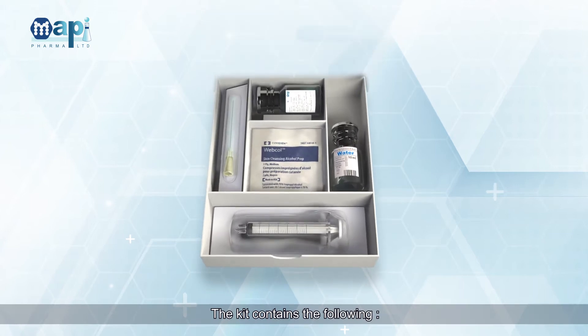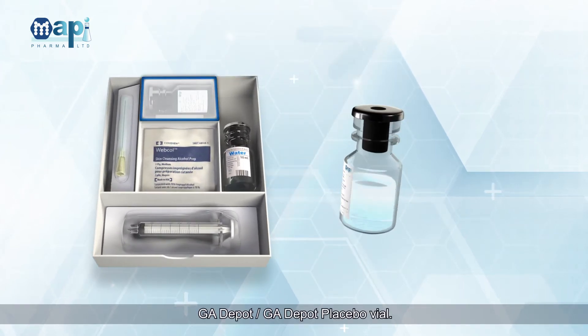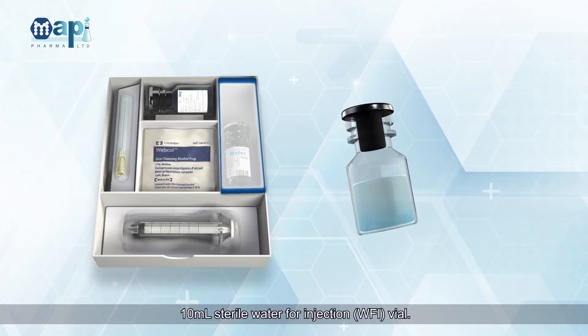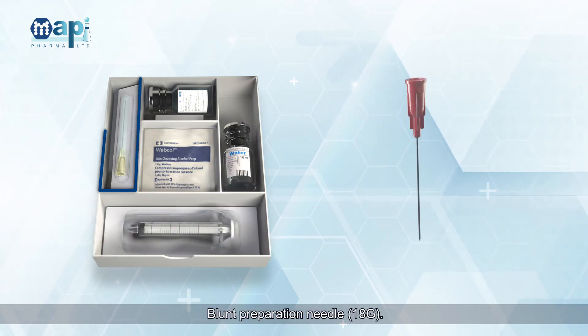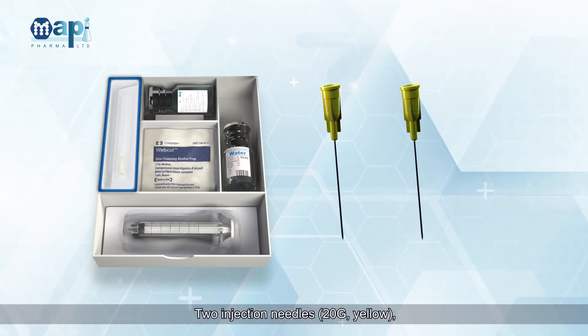The kit contains the following: GA Depot or GA Depot Placebo Vial; 10ml Sterile Water for Injection (WFI) Vial; 3ml Graded Syringe with Luer Lock; Blunt Preparation Needle, 18 Gauge; 2 Injection Needles, 20 Gauge, Yellow.